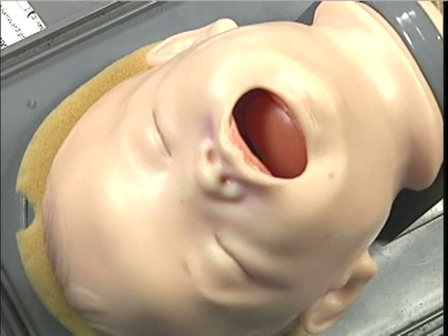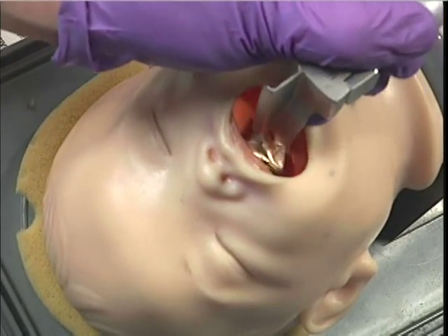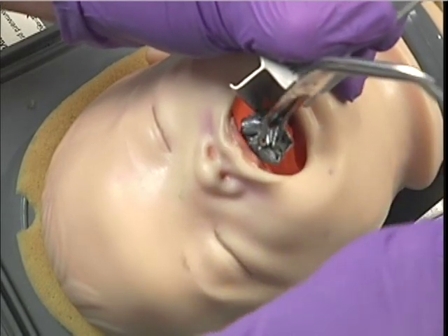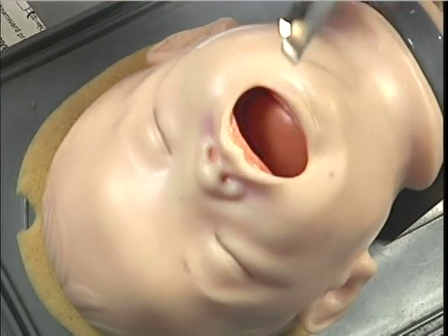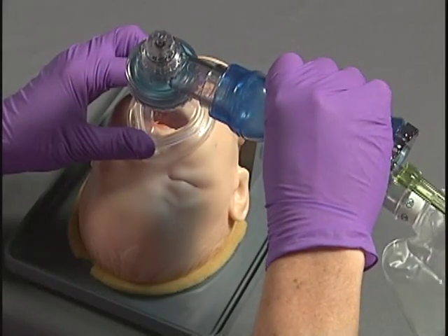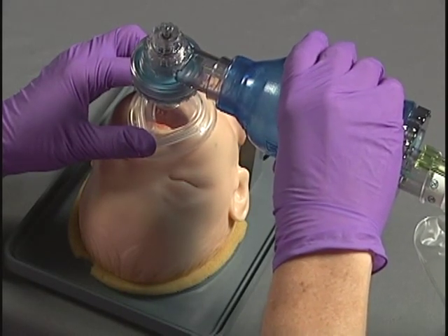From the cephalic position, insert the blade into the right side of your patient's mouth and displace the tongue to the left. Visualize the obstruction. Hold the McGill forceps in the right hand and remove the obstruction. Visualize the airway for any further obstructions before removing the laryngoscope blade. Finally, check for adequate air exchange and ventilate as necessary.